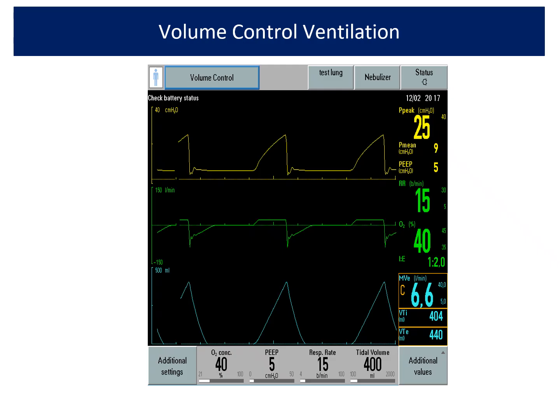But if you ask me, the only curve you really want to see is always flow time. So if you are going into the ICU and in volume control ventilation you are seeing only volume time but not the other two, then it's a problem. Probably no one is looking into it, right? The flow time curve will give a lot of information, as well as the pressure time.